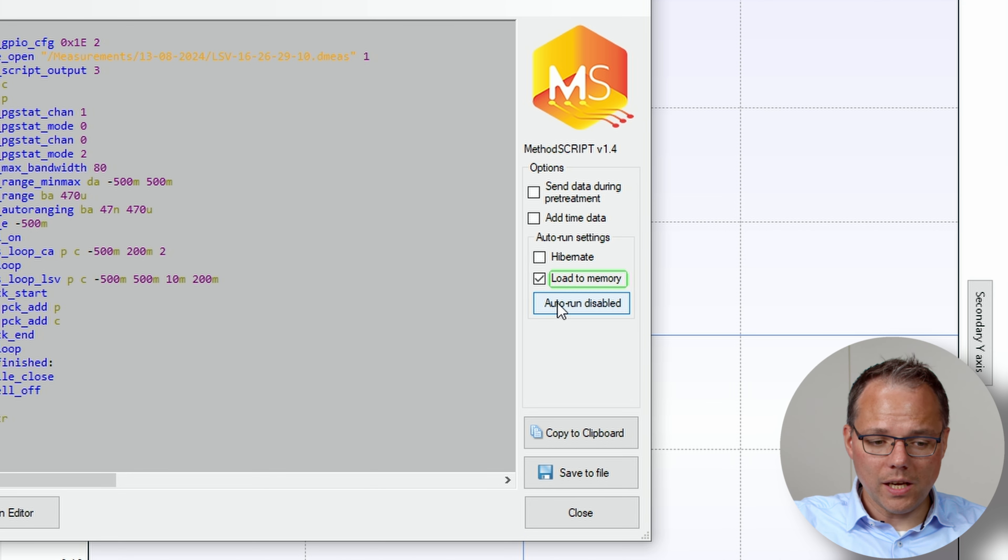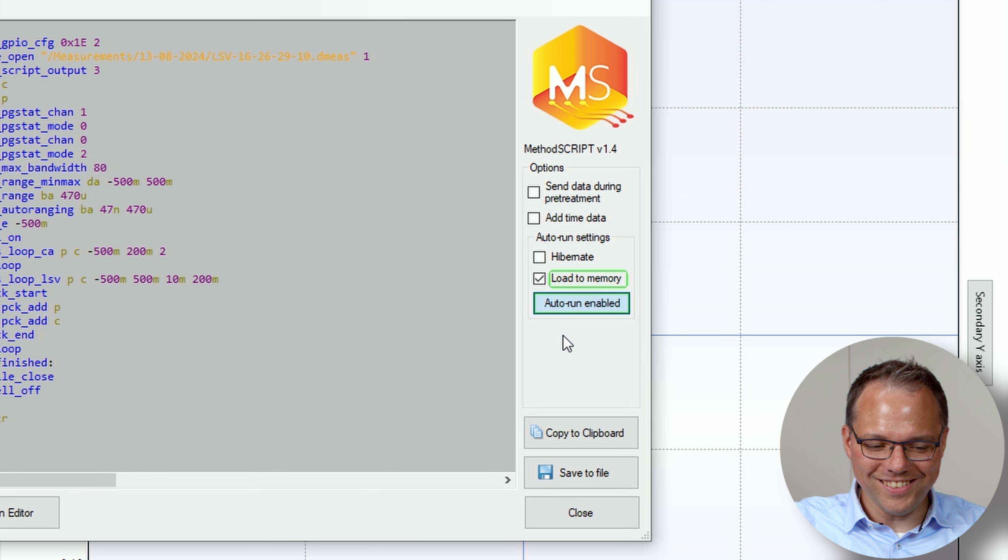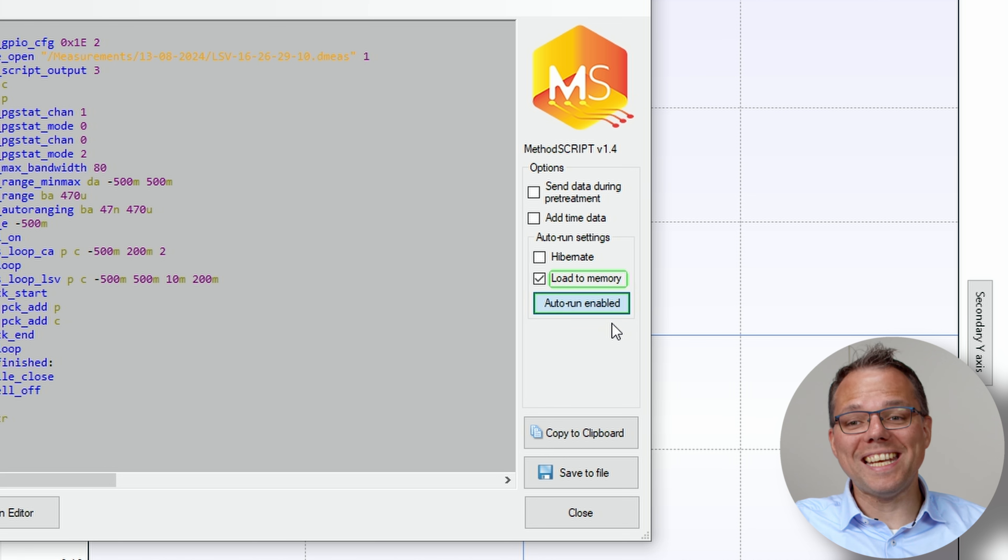If you then activate the auto run, so if the auto run is enabled, these parameters that are loaded at startup will immediately be executed.